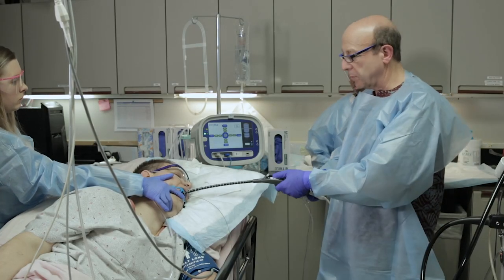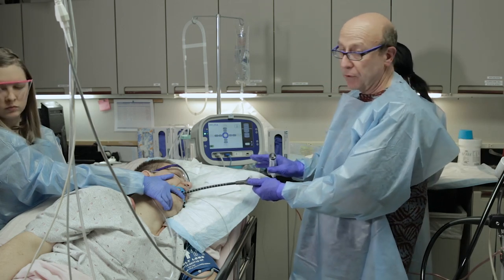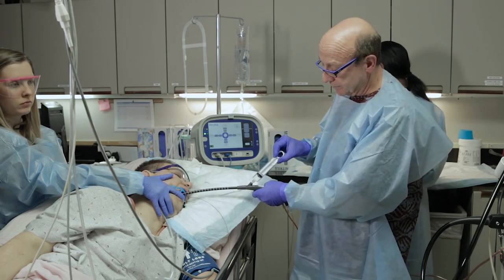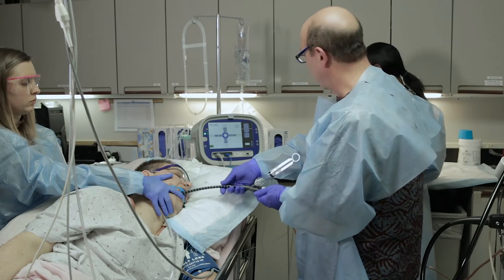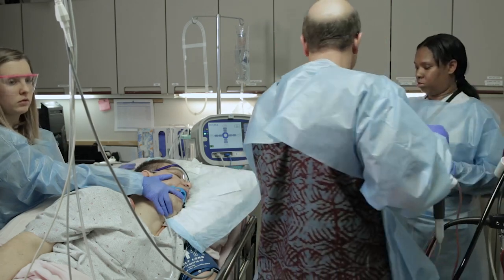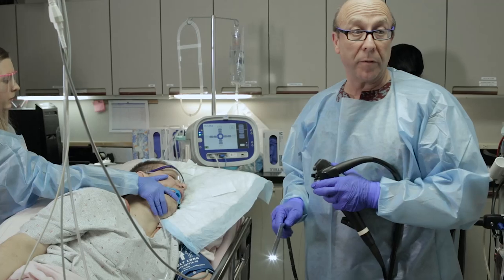It's taken approximately 16 minutes to complete this treatment. The needles are pulled back and the catheter is placed back in the stomach to drain the extra fluid before we remove it — again, to avoid complications such as aspiration. We remove the air from the balloon and withdraw the catheter. At this point we're going to go down and take a look at the effect of the procedure.